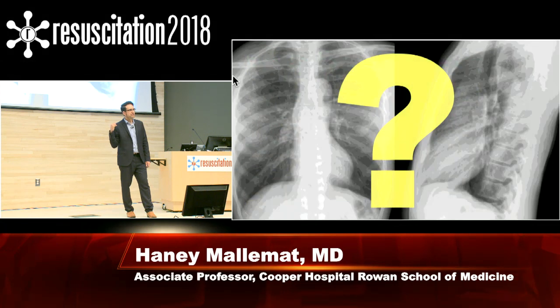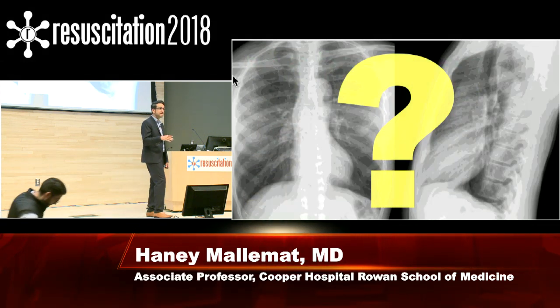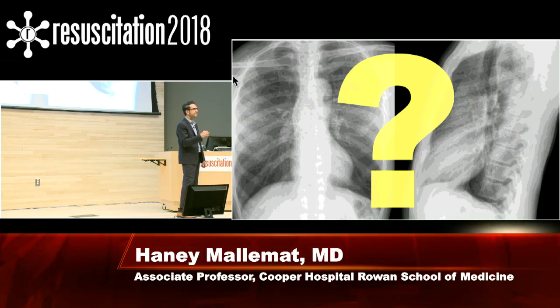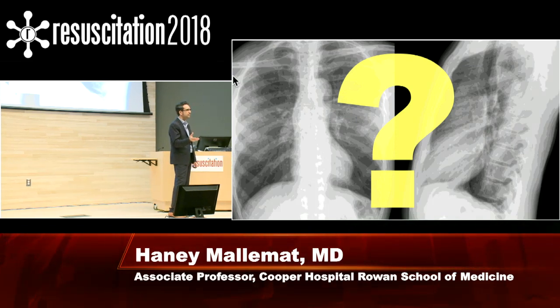Now, why did my patient code? As a reminder, I stupidly did 10 over 5, 15 over 10, 20 over 15, and then 25 over 20. Why did that patient code?